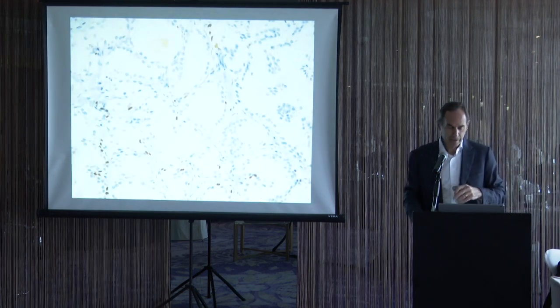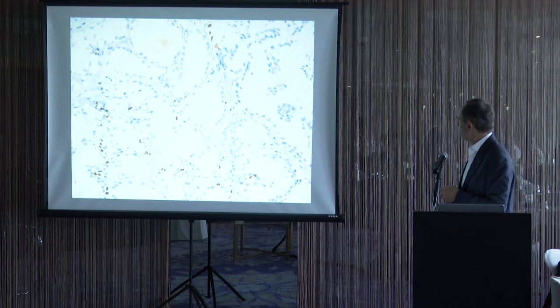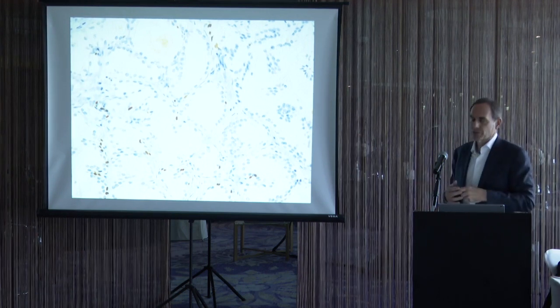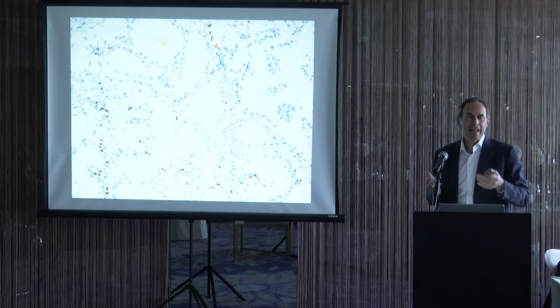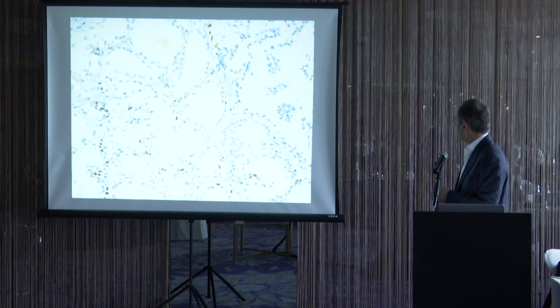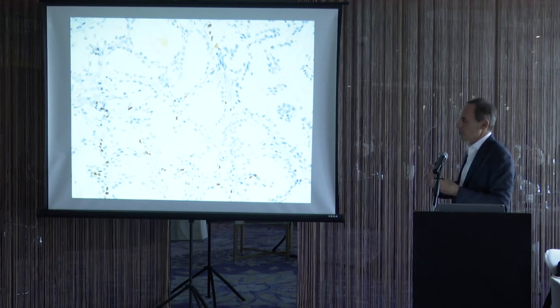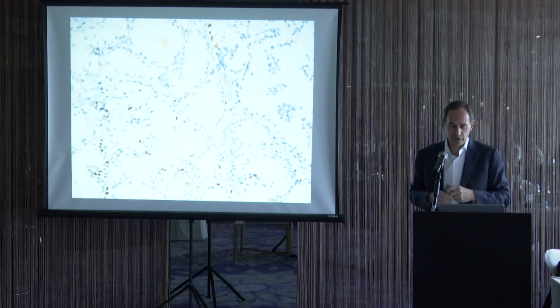features. This is a P63 stain that was done by the outside pathologist. And we can see the same problem that we have with partial atrophy, you have with adenosis, meaning you get very patchy staining and not every gland will stain. So there will be some glands that are negative, some glands with just one cell, some glands with maybe a few. But the ones that are negative look identical to the ones that are patchy, just the same logic we used with partial atrophy. The whole lesion is benign, including the ones that are negative.